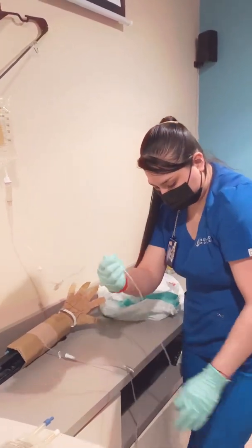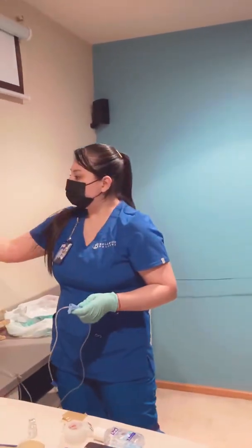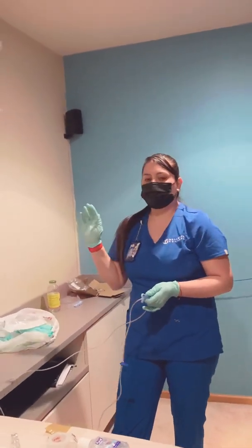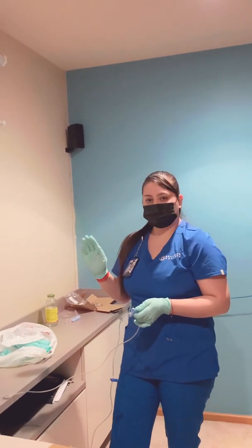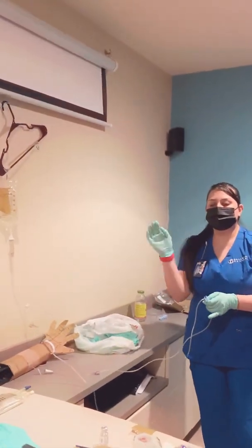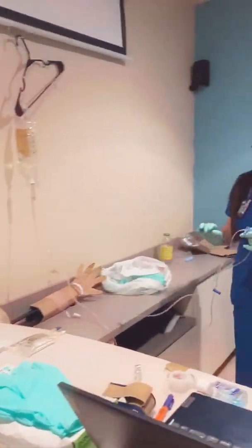And now I'm going to adjust the rate here using my roller, and it is going to be 21 drops per minute, and I'm going to calculate that in 5 drops per 15 seconds. And the way I calculated was volume divided by time in minutes times the drip factor that was on my IV set.